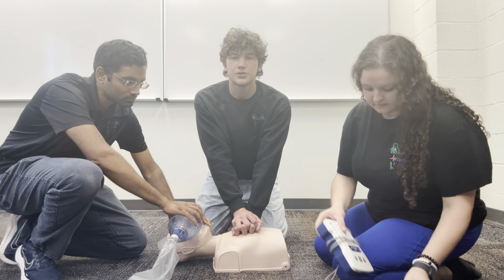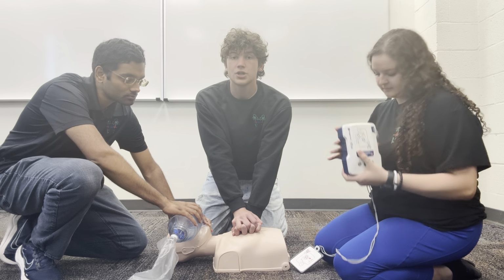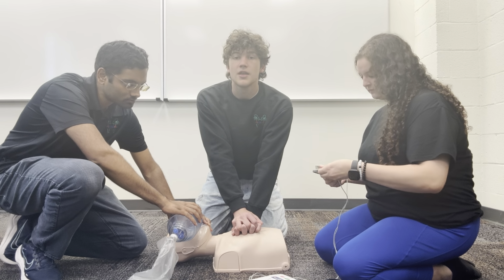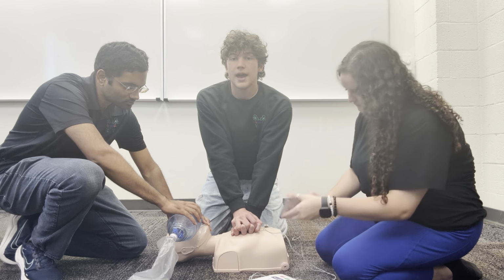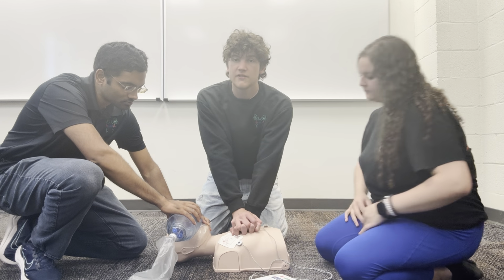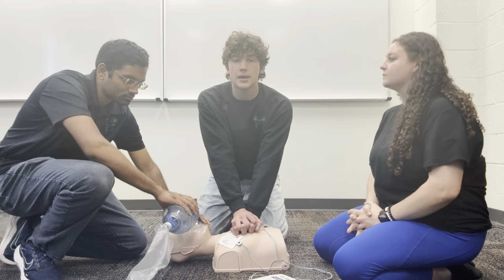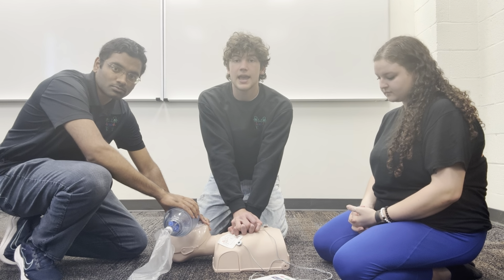The automated external defibrillator is used to correct abnormal cardiac rhythm and restore normal cardiac rhythm. The first thing to do with an AED is to turn it on. Then you will apply the pads to the upper right and lower left quadrants of the patient. Never stop CPR during the application of pads. Once pads are applied and the AED is turned on, the AED is going to say analyzing rhythm.